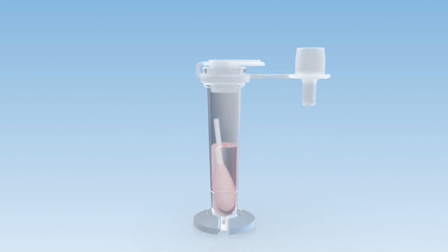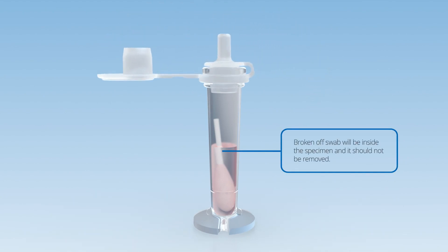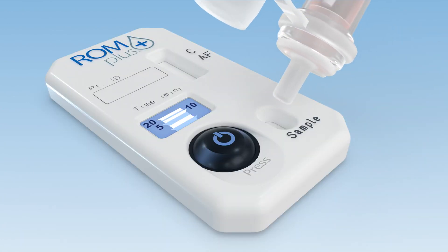Once the sample is received in the lab, replace the shipping cap with the dropper dispensing cap, or if using the point of care, the dropper cap should already be in place. Place 4-6 drops into the cassette sample well.